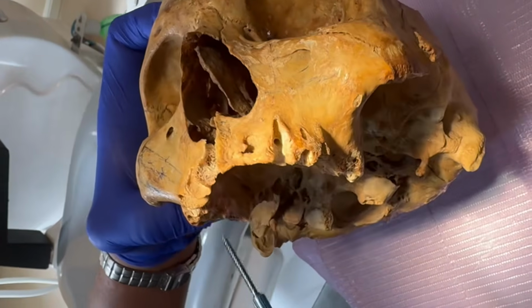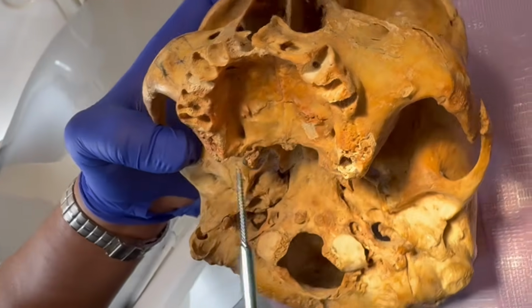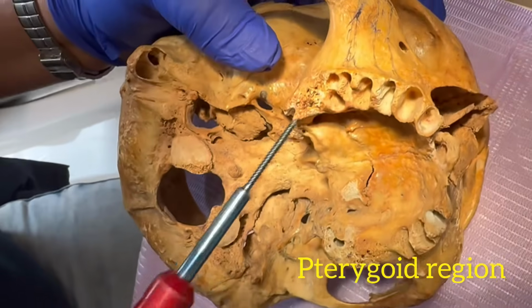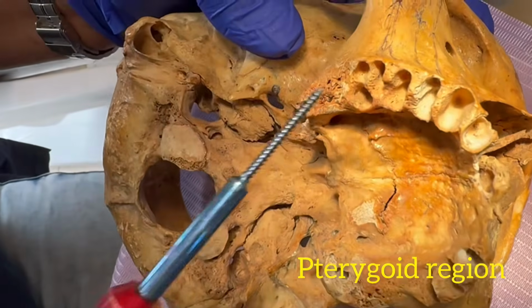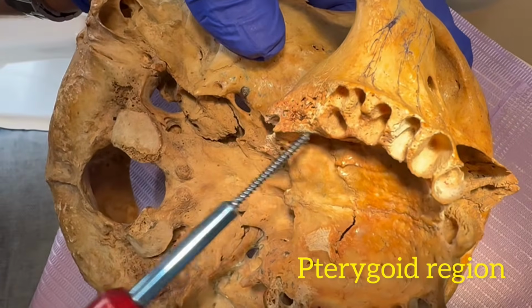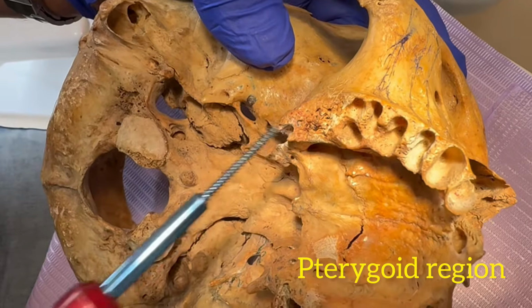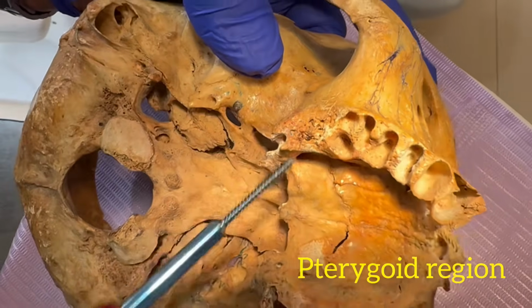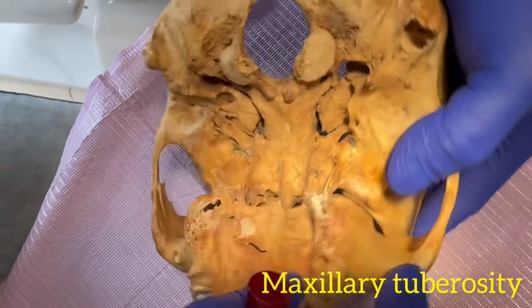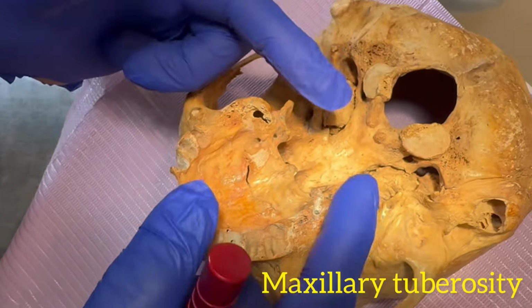So today I'm emphasizing more on the pterygoid region, placement of pterygoid implants. So you can have a look at the extraction socket. This is the first molar. You can have three roots here. Second molar region, and this is the third molar region. That is the tuberosity area. You can see on either side the tuberosity. Tuberosity on both the sides is a little curved medially.